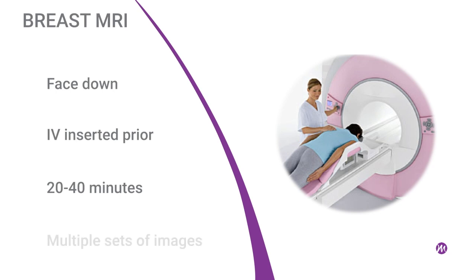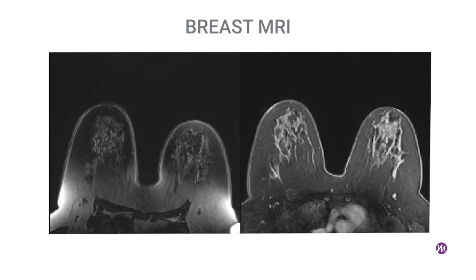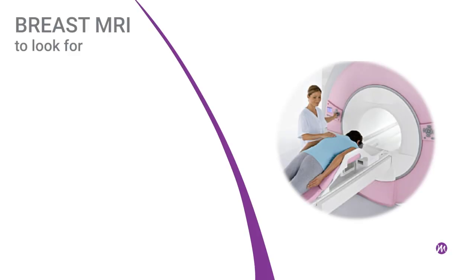And they'll do different sets of pictures to show us the breast tissue differently than we see it in ultrasound. For some patients, we use it in individuals who are high risk or have extremely dense breast tissue. And it basically shows us everything. You can see through everything, and there's contrast. Most of what enhances on an MRI is not going to be cancer, but it's something that we use its shape. Many of us use a dedicated 3D workstation to interpret these images.